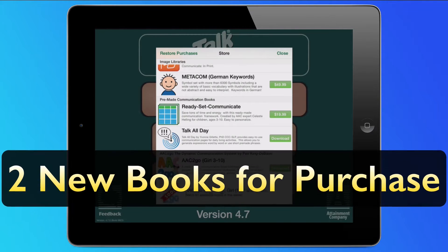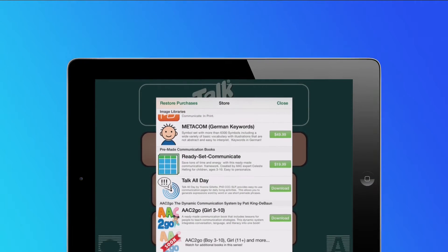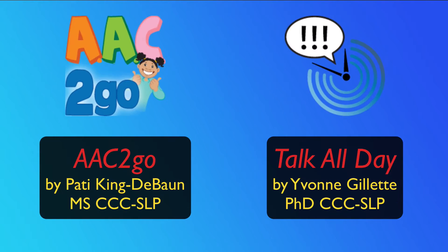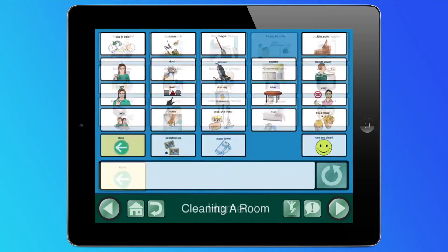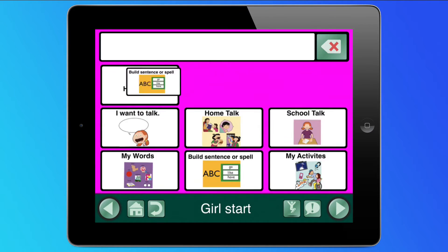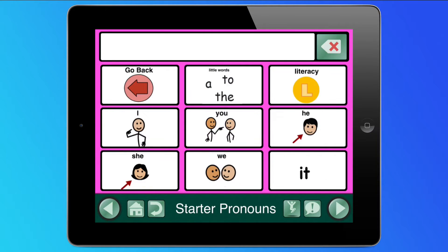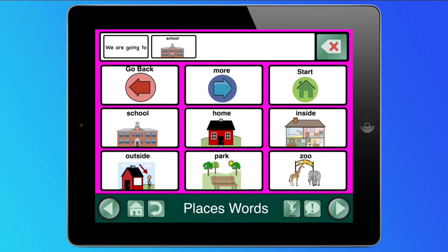We're also very excited to announce a couple of new ready-made communication books, available for purchase in the GoTalk Now store. Authored by certified speech-language pathologists, both AAC2Go and TalkAllDay are dynamic yet easy-to-use communication systems. TalkAllDay provides communication pages for daily activities, and AAC2Go integrates conversation, language, and literacy for young girls. More books in the AAC2Go series are coming soon.